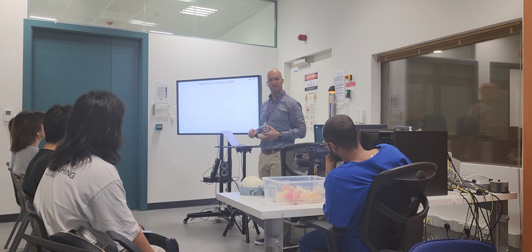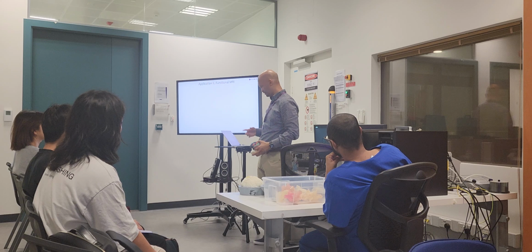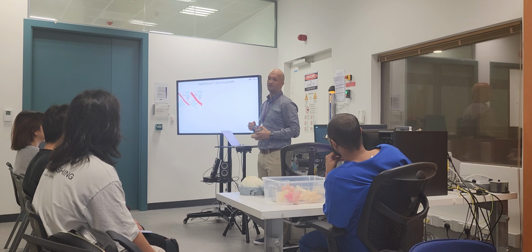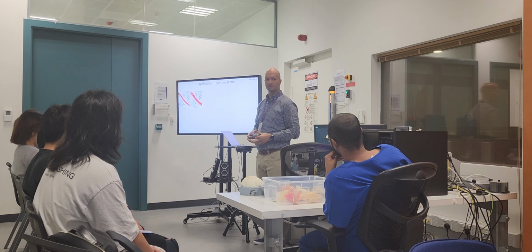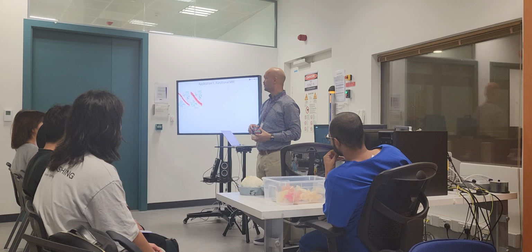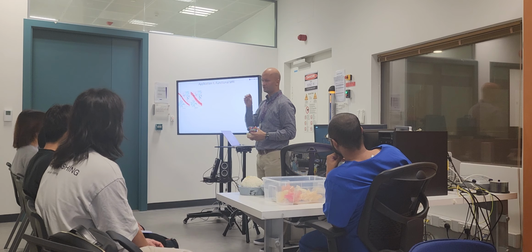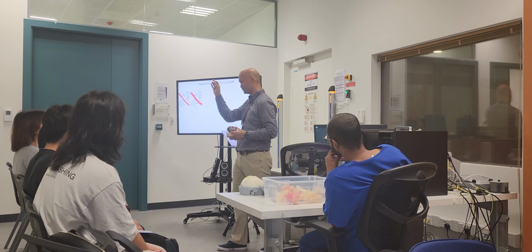Function. How do we do function? Scan. Tap finger and stop. Tap finger and stop. What happens? This is the phenomenon. It's a phenomenon that is built on the imaging. Okay? You studied T2 star? We didn't cover it. You studied T2. Yes. Okay. So I'll discuss briefly just because you guys know what T2 is. So I'll just upgrade your knowledge by introducing T2 star just briefly.